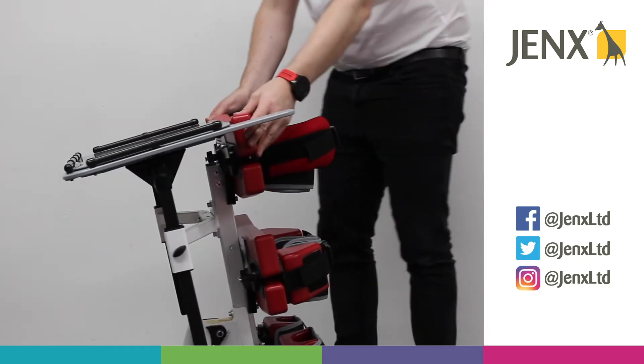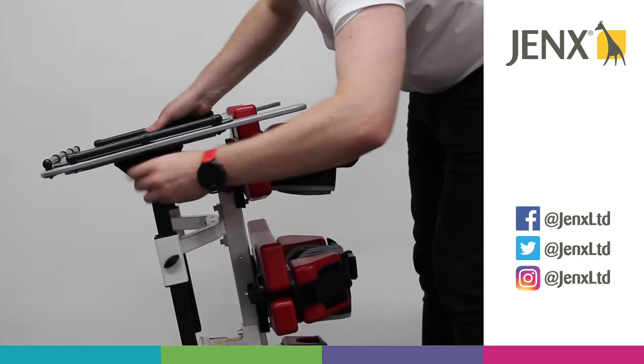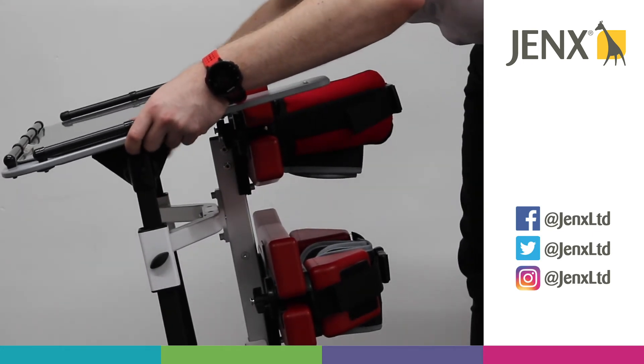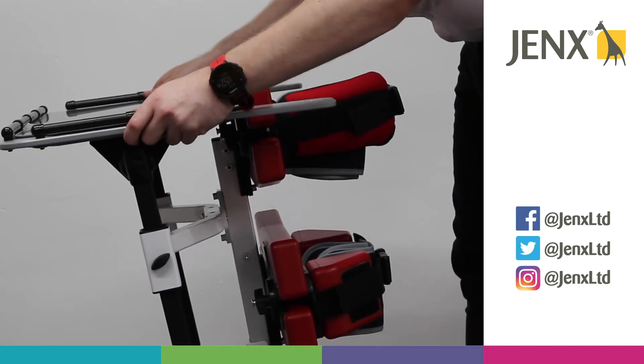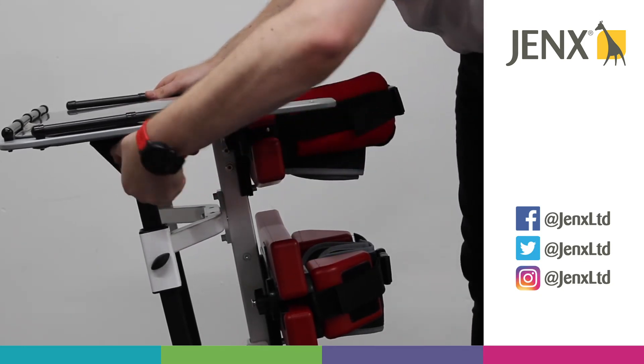If we'd like to change the tray angle, we've got two more wing knobs here on either side. We can loosen those off and we're able to adjust the angle of the tray.